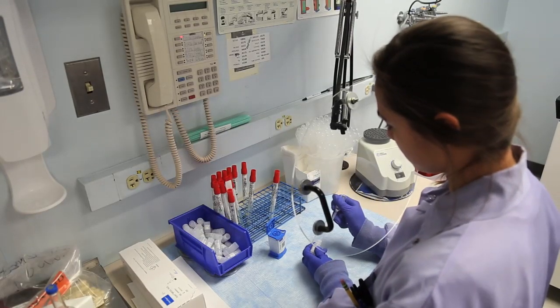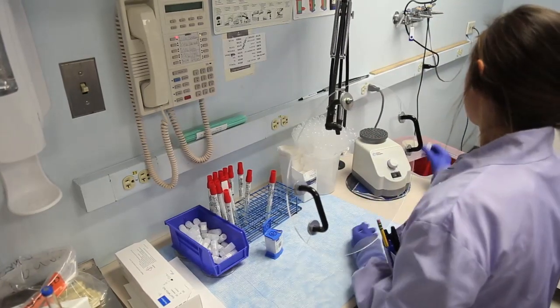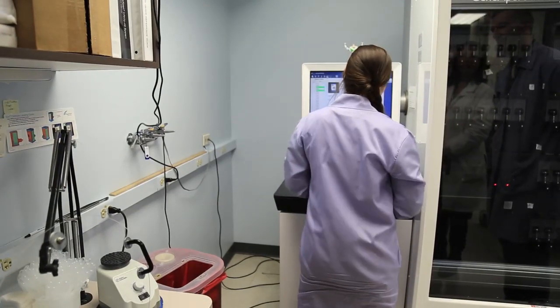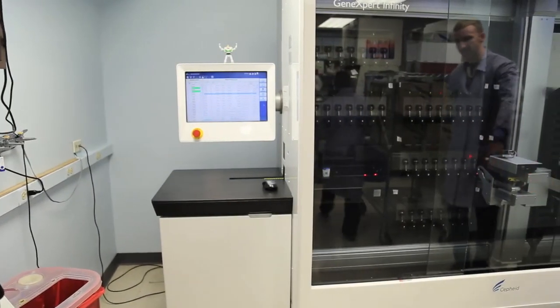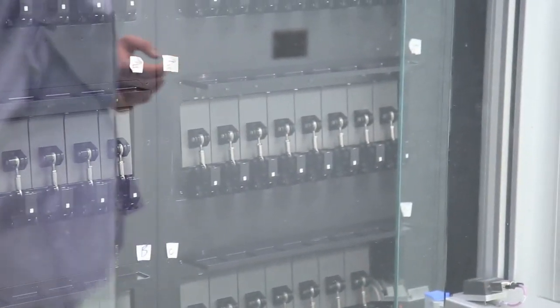So it's very simple. It's not the PCR you're used to doing in college where you have to wait hours and hours and do all the sample prep. Then she'll come over here and scan the 2 barcodes, the patient barcode and the cartridge barcode, and it goes on a belt and gets loaded right in. You'll see this gantry arm come over, take it, and put it into its specific testing door. Once again, this is completely random access, so as the tests come in, they can be put on right away. There's a lot of troubleshooting involved as well.